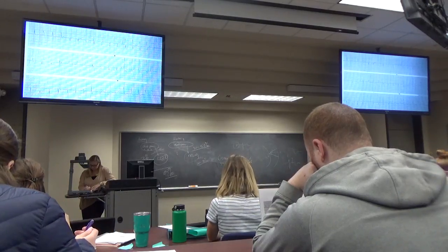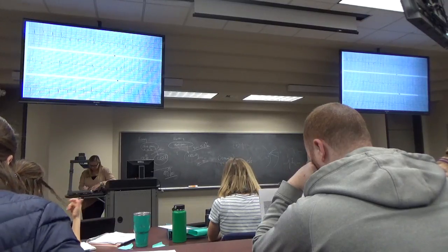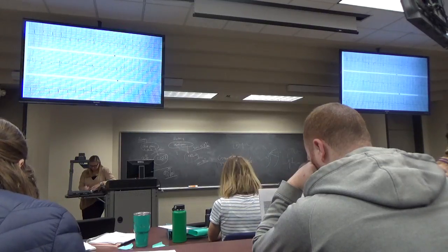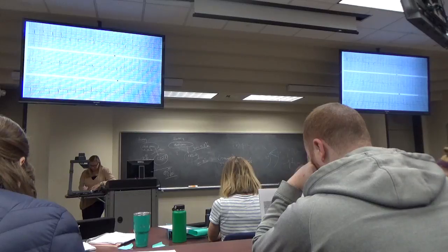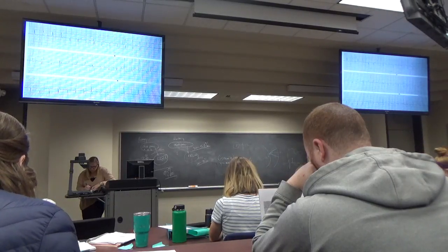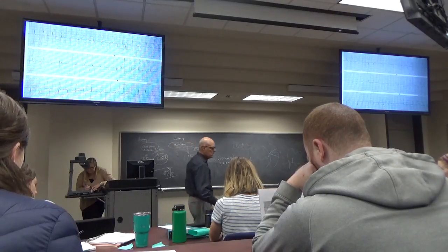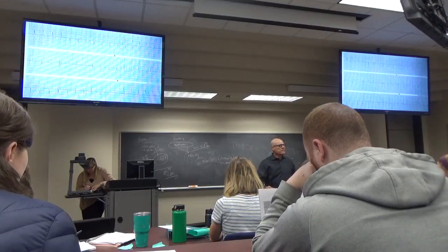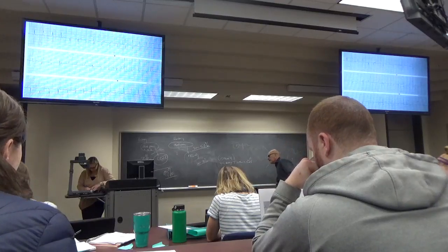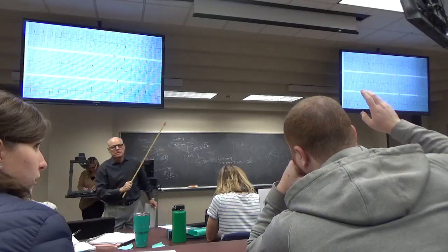Okay, so he's calling it atrial fib because he can't see P waves. He's calling it ischemia of the lateral wall, is that right? Yeah. And left ventricular hypertrophy or not? No? Left axis deviation. Anyone find P waves? Does this look like atrial fib? No. How come? It's too regular. Yeah, atrial fib should be irregularly irregular. So if it doesn't look like atrial fib, it might not be atrial fib. We better look harder for P waves.